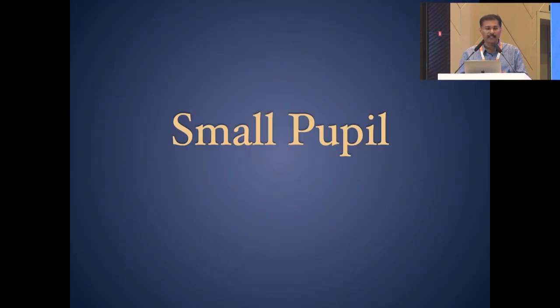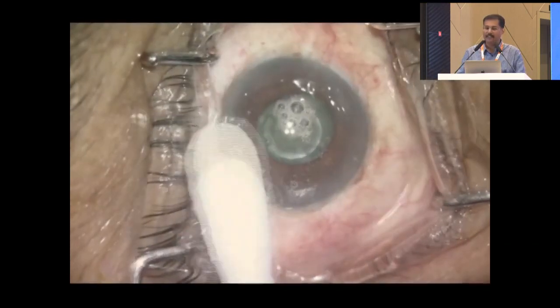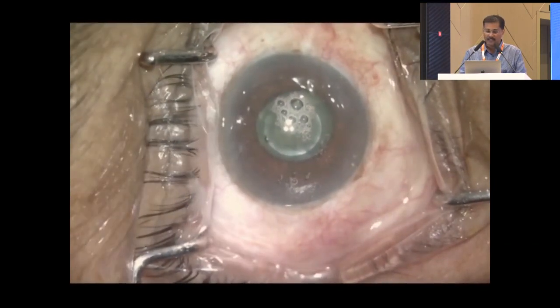In small pupil, here comes the limitation. So it cannot pierce iris, that's for sure. If you have less than 3, there are people who show that you can put in a ring, take out visco or retain visco, suture, and bring the patient back. Or there are now machines where you can do it in the same room, but then still you open up the globe and then bring something in. You can still do it sterile, but I don't recommend that. I don't like it. So small pupil less than 3.8 or 4 millimeters, I do not do.